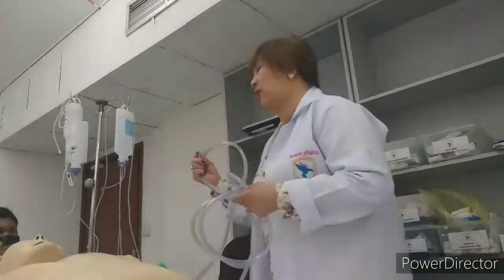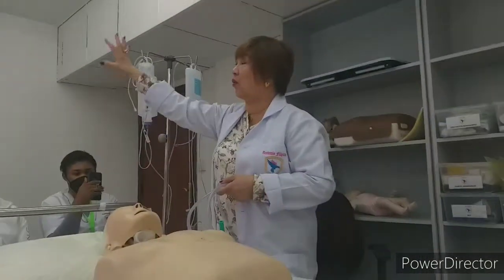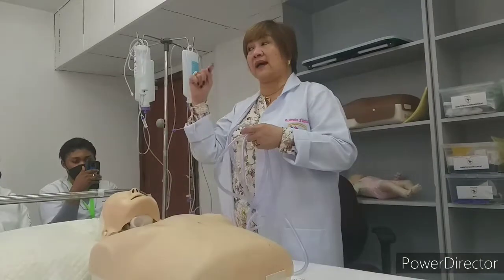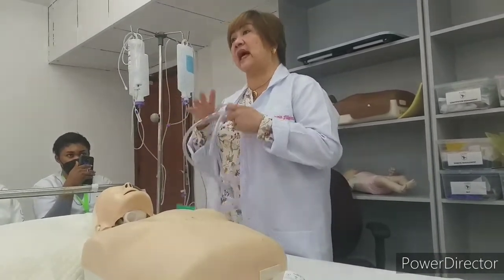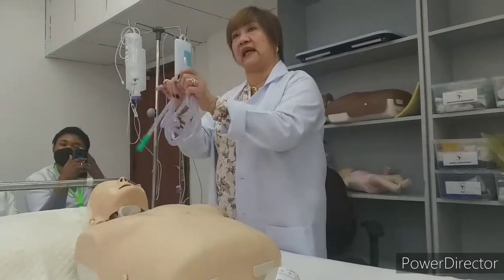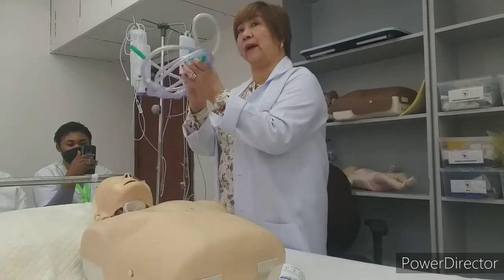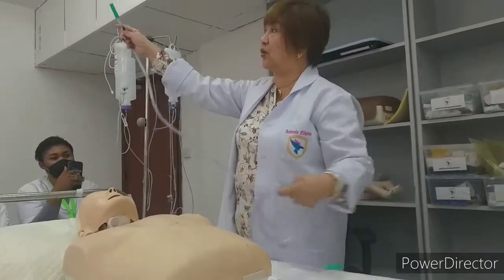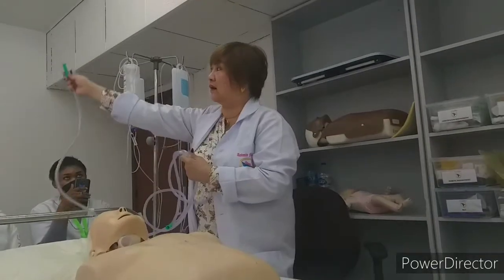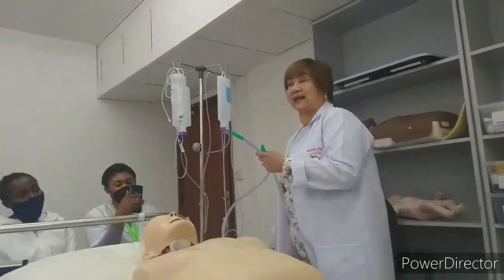Okay, so now we will go with our suctioning. As I said, we have a wall-mounted suction machine. So we have to prepare first. You, as the CNA, or the nurses themselves, are the ones preparing this. All of these are in a sterile pack. You have to open them. We have the wall mounted suction, connect, and the end of this will go to a canister.